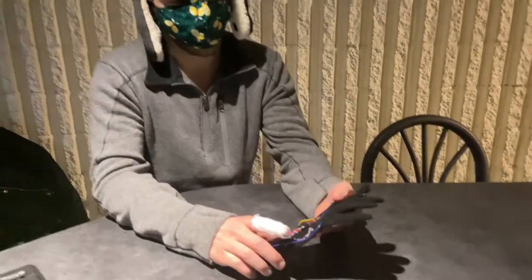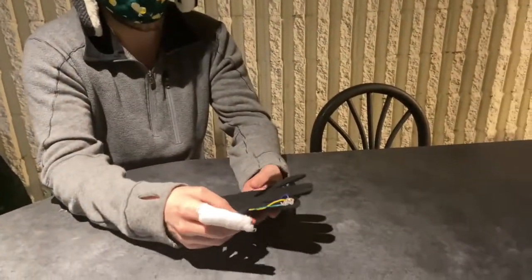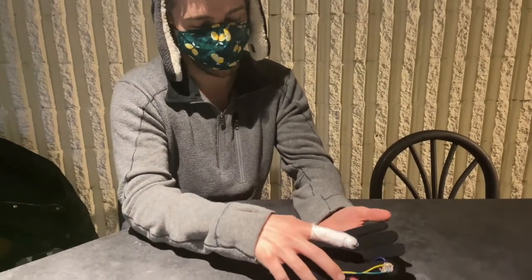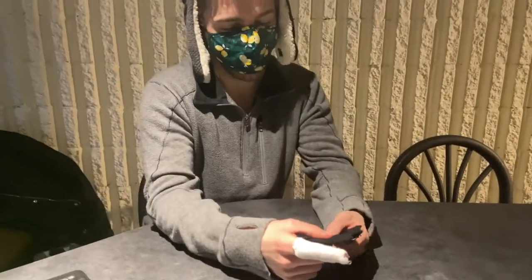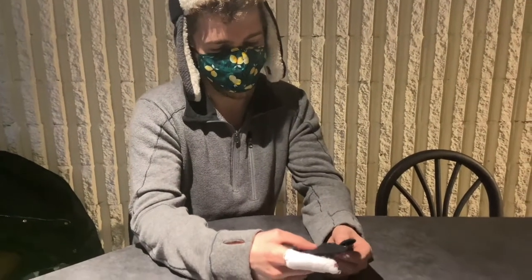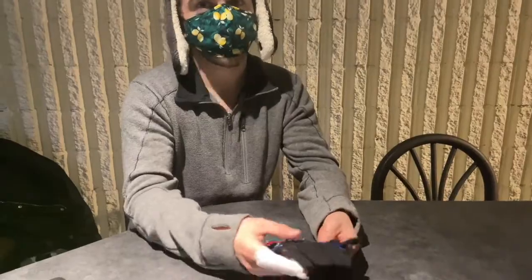Another thing we could do to improve the glove would be to add distance sensors on the fingertips. So the users could also sense how far they are from the object they are sensing, and the vibration motors would increase in magnitude the closer they got, and that would allow them to pick up objects better and sense the objects better that they are scanning. Hope you enjoyed our presentation.